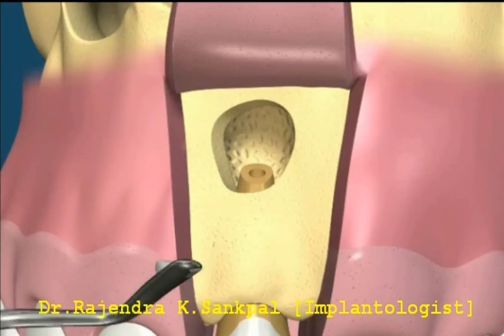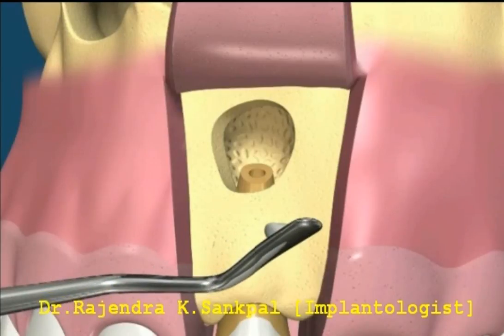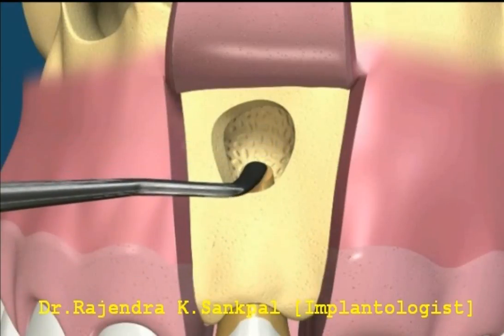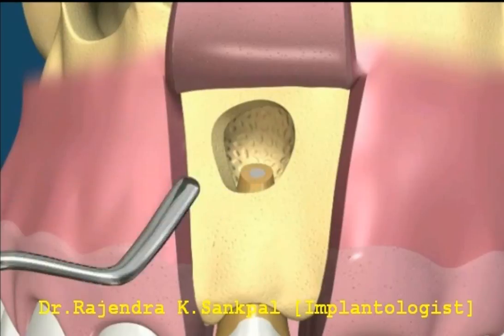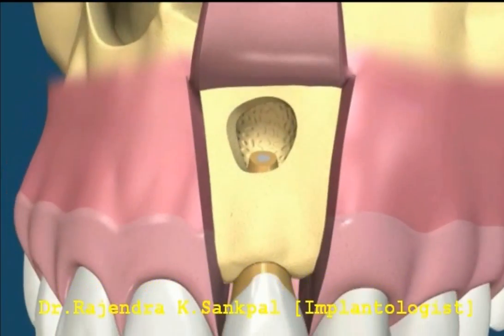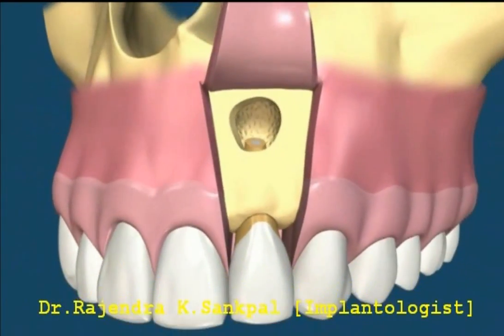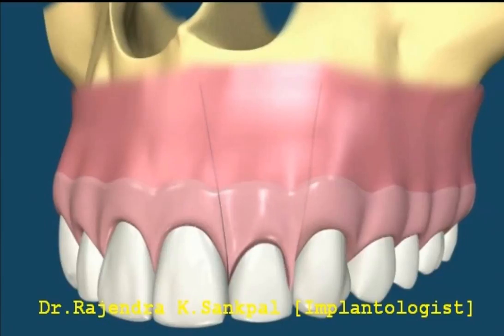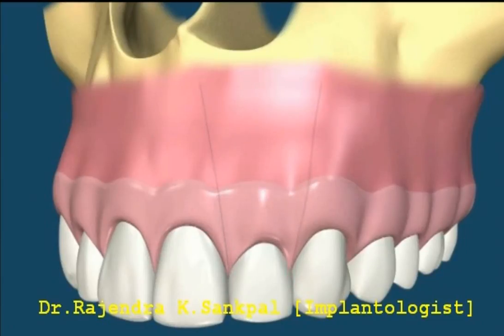Finally, a filling is placed into the prepared site to seal the opening. The flap is repositioned and sutured into place.